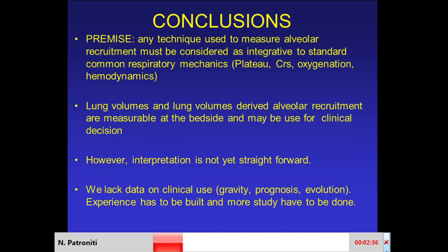I go to my conclusion, starting with the premise that I already told you, that any special technique must be integrative of standard respiratory mechanics knowledge. Always, you will rely on that. Is it feasible to measure lung volumes? Yes, it's feasible, but you need the machine. I hope that more ventilators will try to have something similar. But the interpretation of the result is not so straightforward.